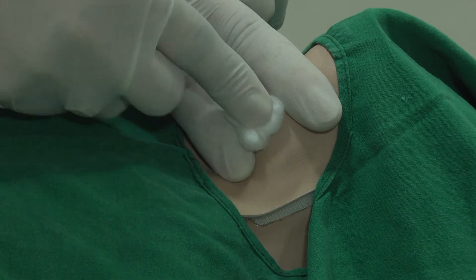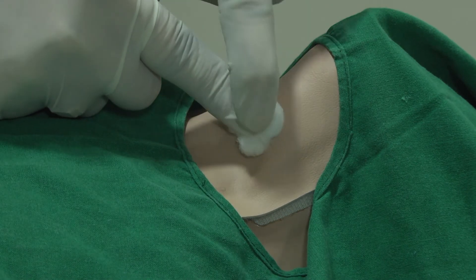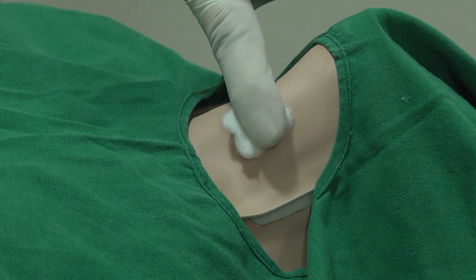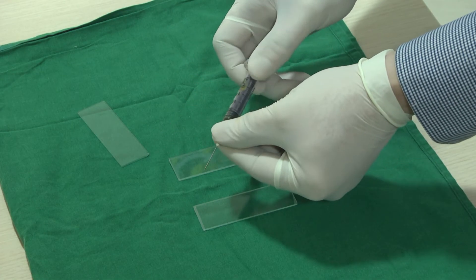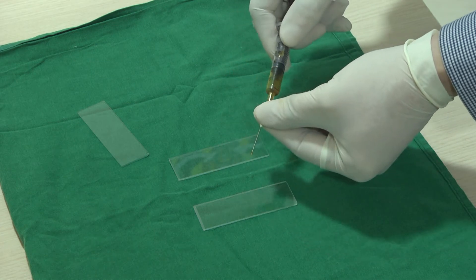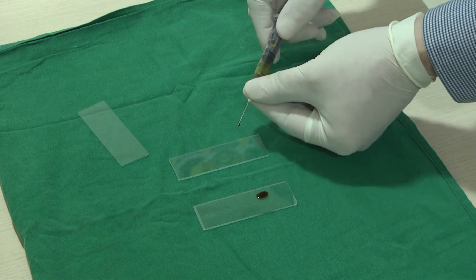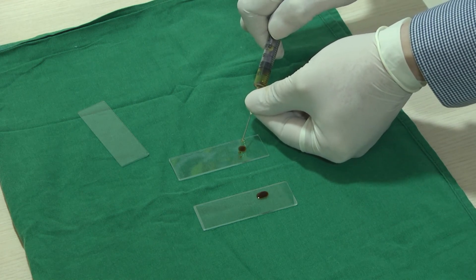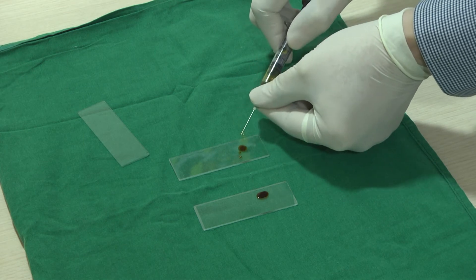Pressure is put on the point with a sterile cotton. To prepare the slides, the needle is disconnected from the syringe. Air is withdrawn into the syringe and a few drops are placed on the slides. This is because most of the material collects in the hub.